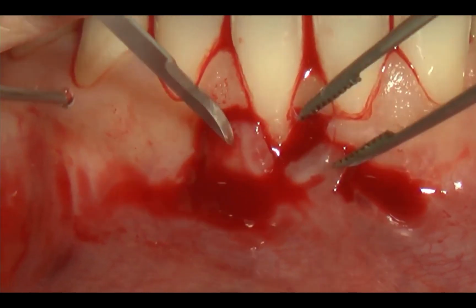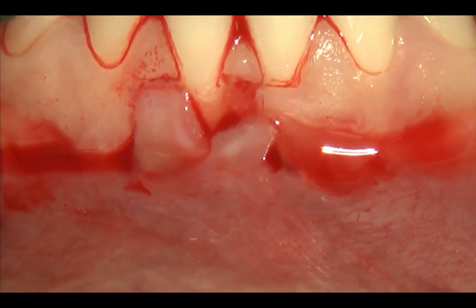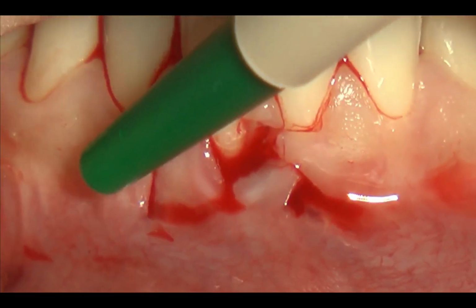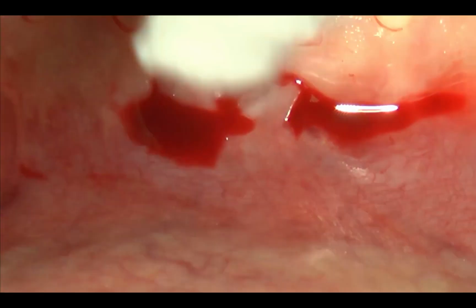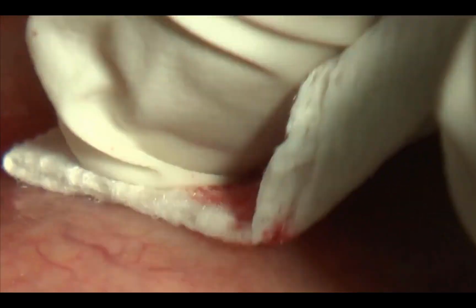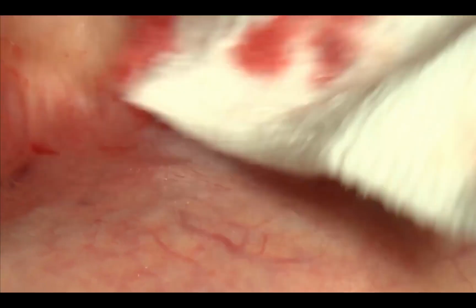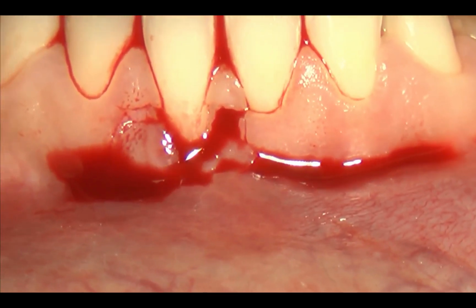And now I will elevate full thickness the small amount of keratinized tissue remaining apical to the gingival recession. I need the small tunnel elevator. It's always important to have a perfect control of the bleeding from outside, because obviously you have such thin tissue that it is really difficult to manage.